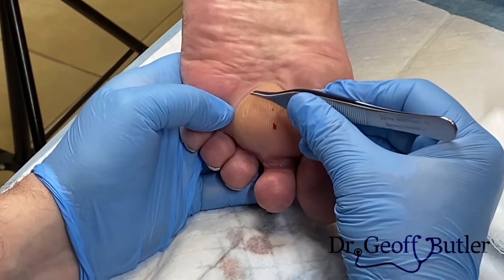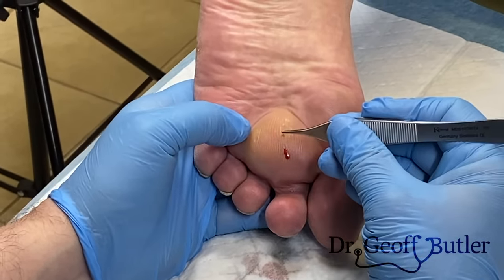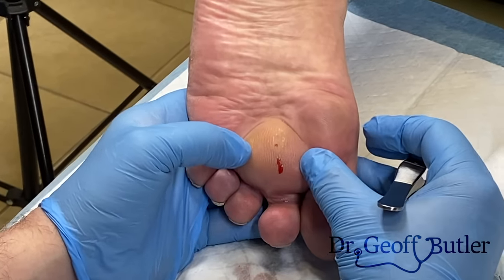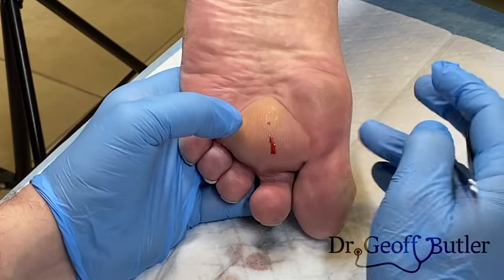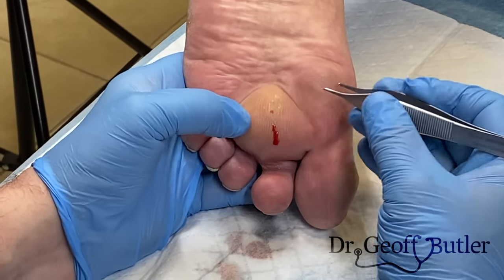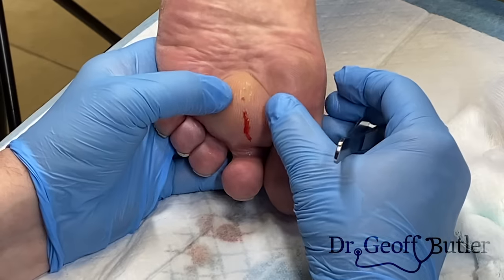This patient is coming in for assessment of a large swollen area on the underside of his foot. How long has this been present? Since October. That begs the question why this has been left going this long — sometimes this is part of the problem with the system we work within. People get worried about what it could be and there's a reticence to move into it. It's been ultrasound. It's a fluctuant mass and at this stage we're going to have to open it and see what we're dealing with.